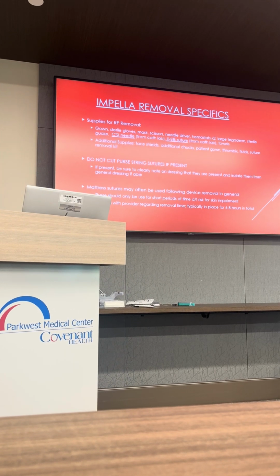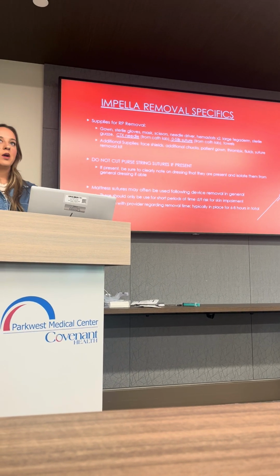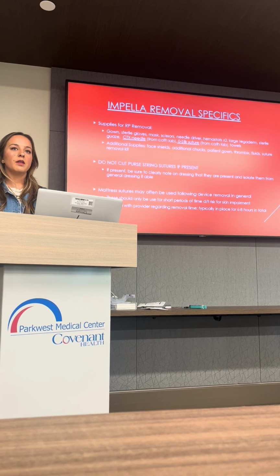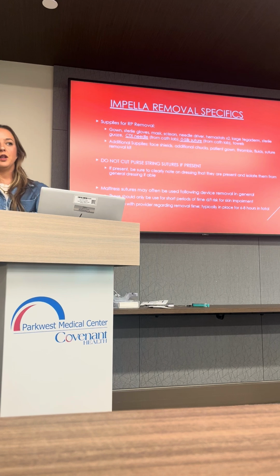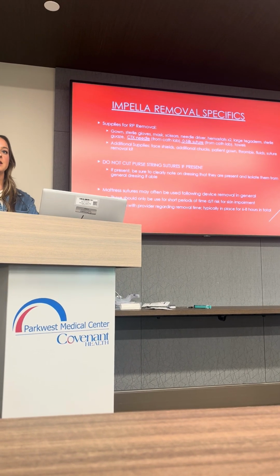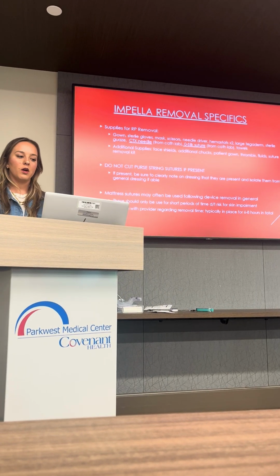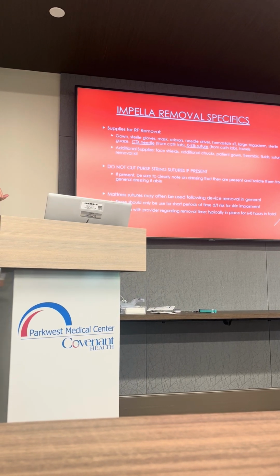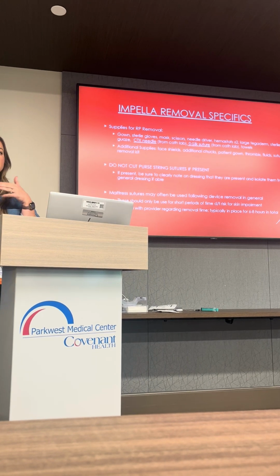All right, so then the last thing is just to talk about some Impella removal specifics. Now, I want to preface this by saying that this can be provider specific. And so the more that you work with some of these providers, the more you can anticipate what they may use or what they may not use, but you can plan accordingly by that. I am slightly biased, so obviously I've put on here what I'm most familiar with whenever I'm present for removals. So supplies that you'll need for a general removal would be a gown, gloves, masks.